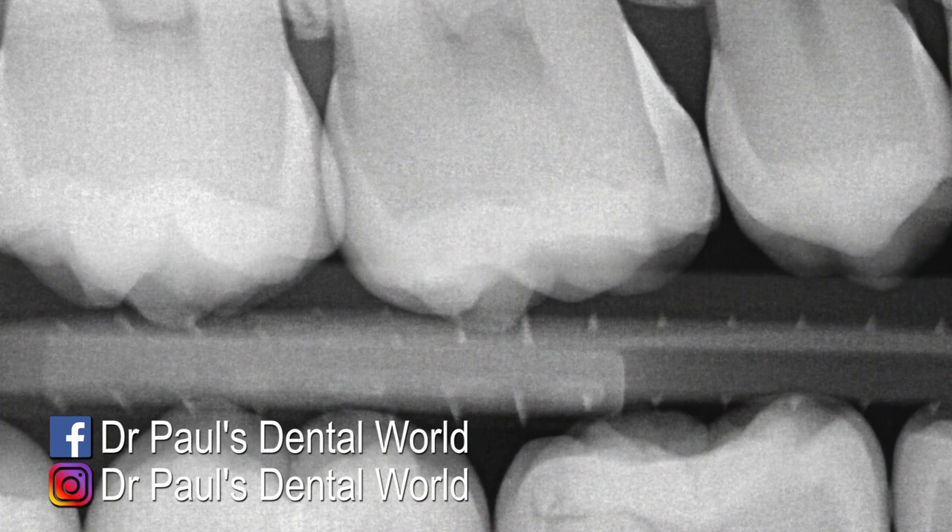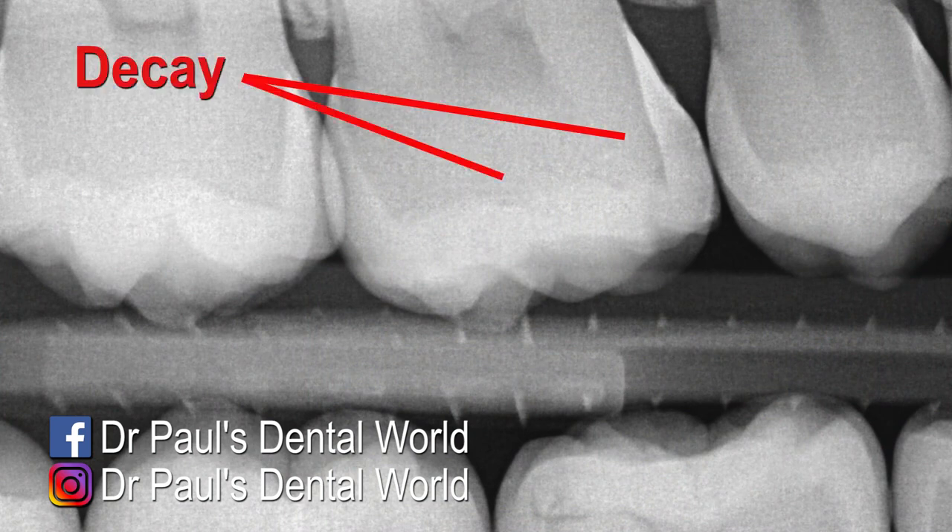If we look at the x-ray, the area of decay is on the front part of the tooth as well as on the biting surface underneath the old filling. So we're going to take out the fillings, clean out the crack, clean out the decay, and then put a new filling in.